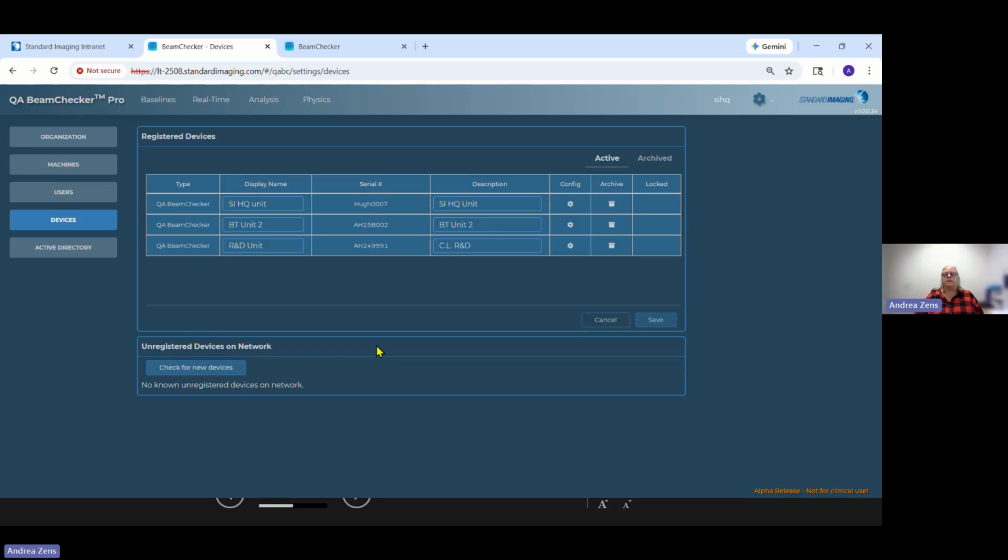Once the device is on and the software is open and running, it's going to do this phone home, so that it's always checking for what will be online. And this device will come online shortly, which means it's available for use. And again, I have a unique identifier for each of the devices because that's part of how the database is organized. So what does that officially mean?